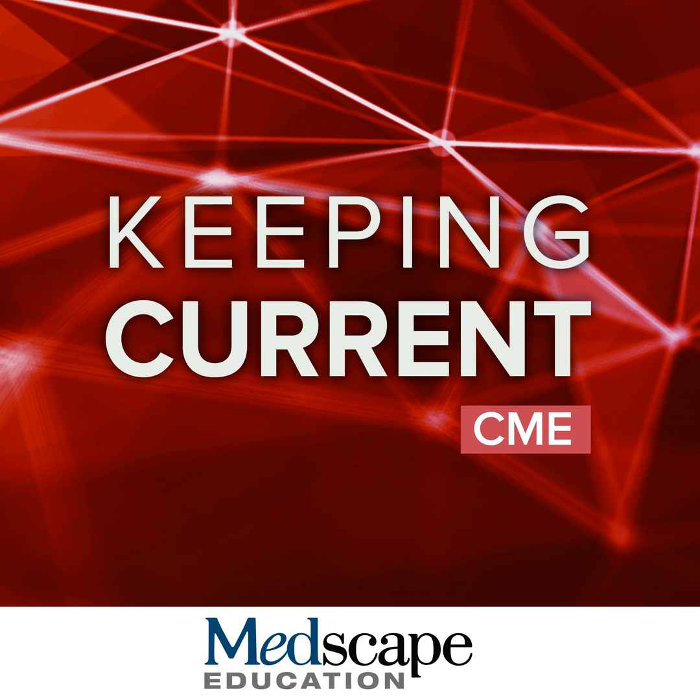So first, for the MRI brain orders, we need to be clear with the MRI brain orders to indicate, is this a patient with suspected Alzheimer's disease undergoing pretreatment evaluation? Or is this a patient on therapy in which we're monitoring for ARIA? At our institution, we've differentiated these by using naming conventions of AD therapy enrollment and AD therapy monitoring.